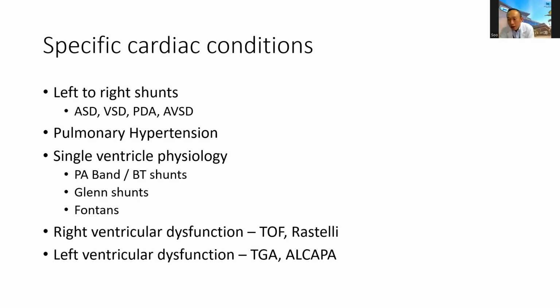If you're asking in terms of the I time, how much I time, we are looking at the tidal volume that we want to deliver and whether we are actually focusing on helping the left side or helping the right side. Because it is a bit counterproductive if you have a very short I time but a very high peak pressure to achieve the tidal volume you want.